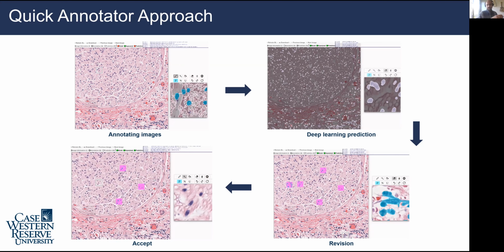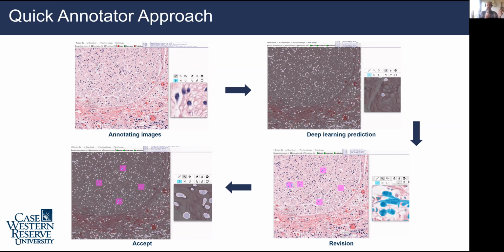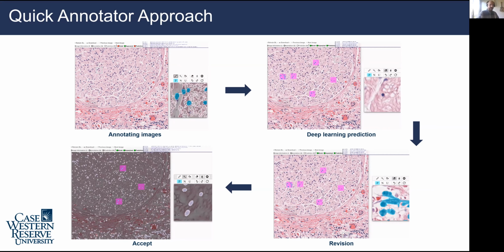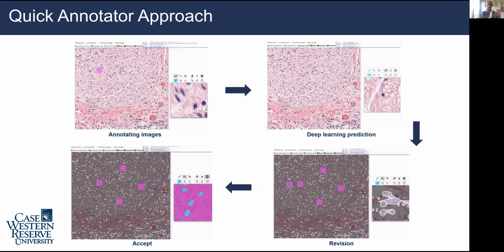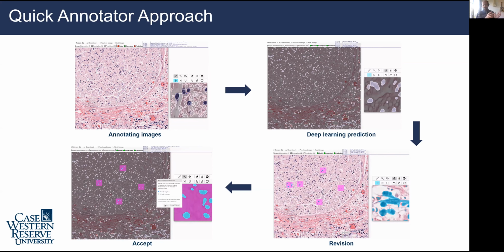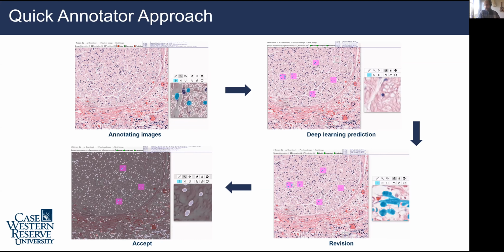We intentionally saved all of the, we'll say, interesting outputs of the program in formats that you should already be comfortable with. So it's not like you even have to go and tinker around with things. It really is just copy those images and they're ready to go. We also provide code, for example, in Patch Sorter and Quick Annotator. They use smaller networks that are, I would say, in the order of maybe 100 to 400,000 parameters. And that's just so you can use it. For example, I can use it on my laptop. But as well, you can train it very quickly.